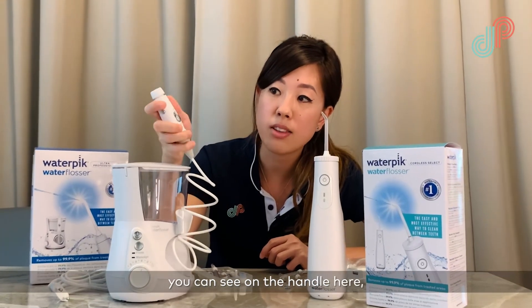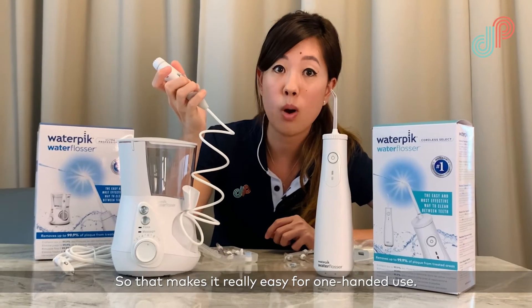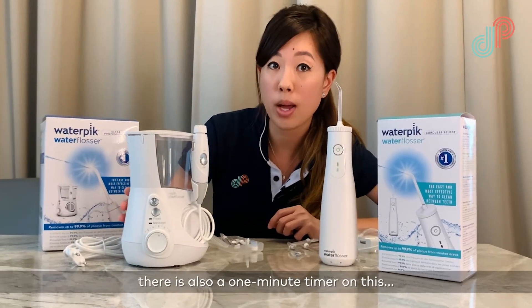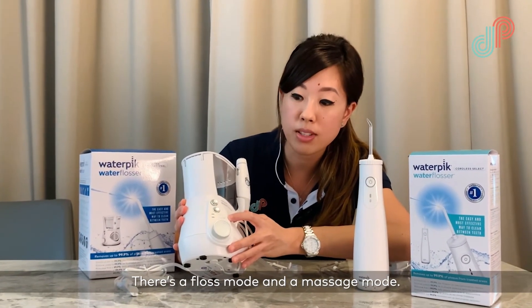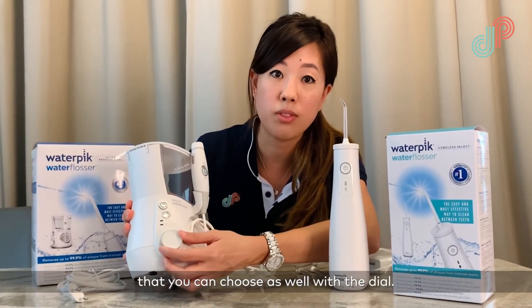Looking at the corded version in more detail, you can see on the handle there's an on and off button, which makes it really easy for one-handed use. There is also a one-minute timer, and you can select different modes — there's a floss mode and a massage mode — as well as 10 different pressure settings that you can choose with the dial.